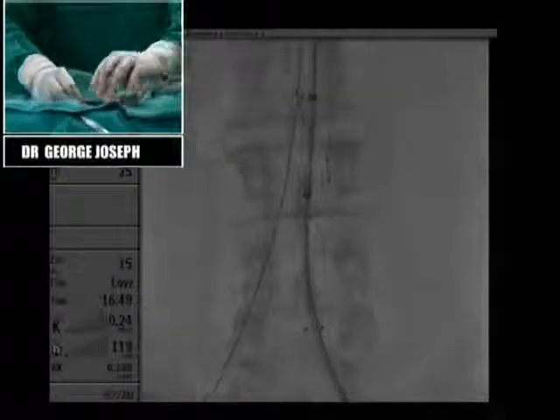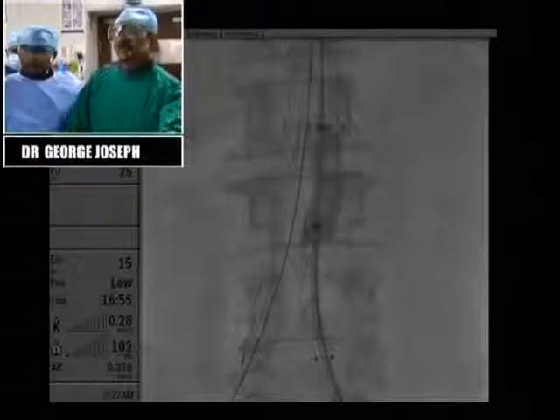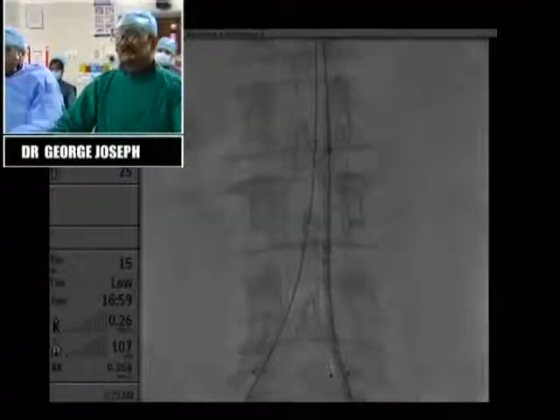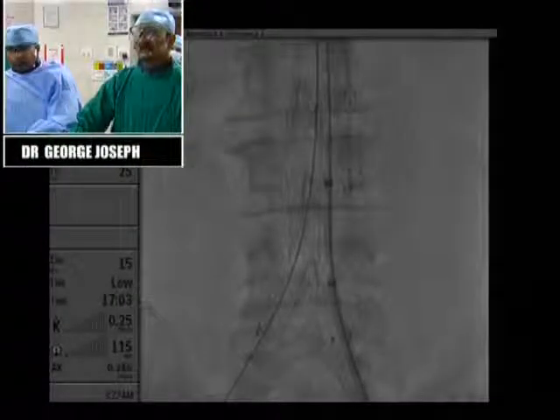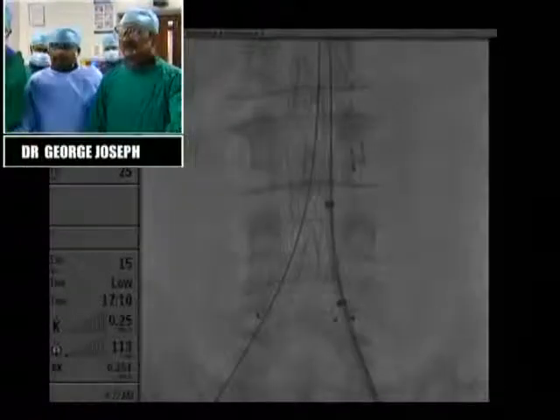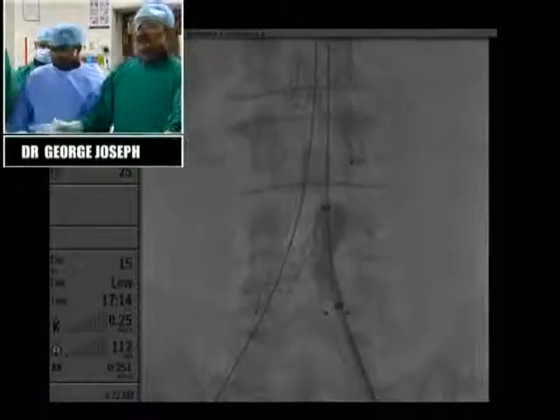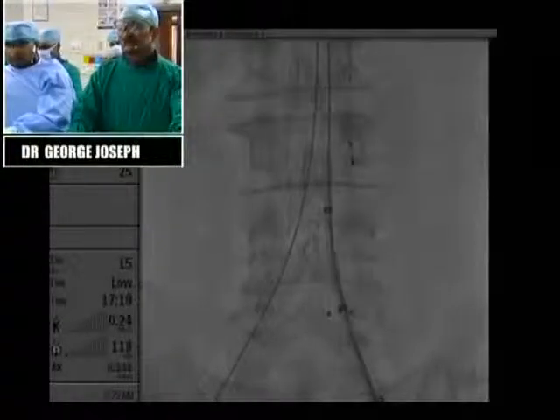Just gently go up there. Okay, down. And pull down. Slowly, slowly. Is there a bit of obstruction there? Okay. Gently here. The amount of pressure you exert is just to make it a cylinder; you're not going to expand anything.